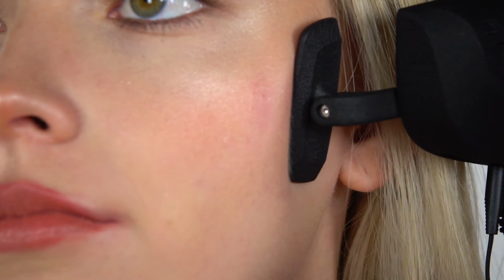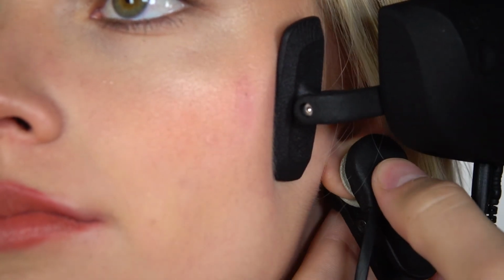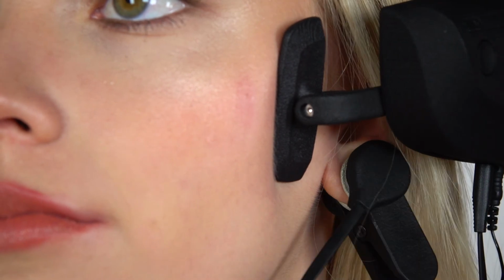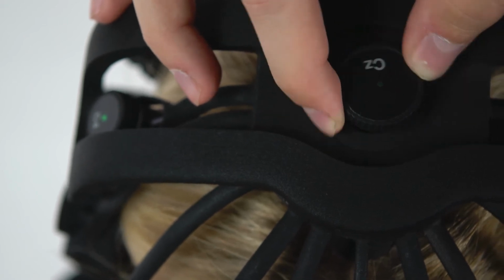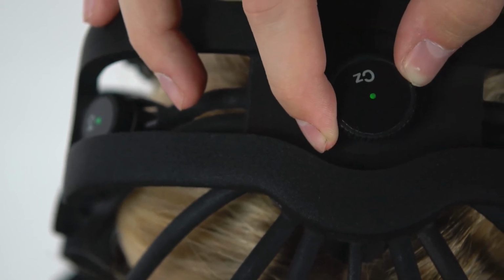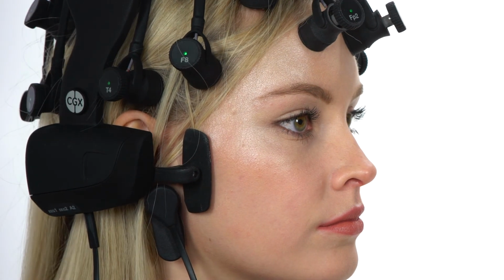Lift the ear pad and place the A1 ear clip on the earlobe. The A1 ear clip with reference and ground attached must be installed to get valid impedance data. Now, push the headset downwards and rotate CZ until the sensor makes good contact. Attach the A2 ear clip and lead wires if needed.